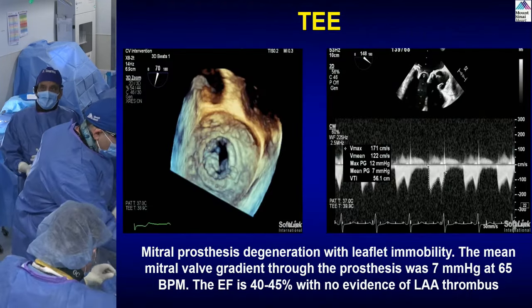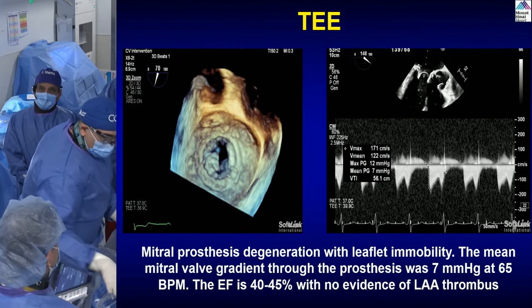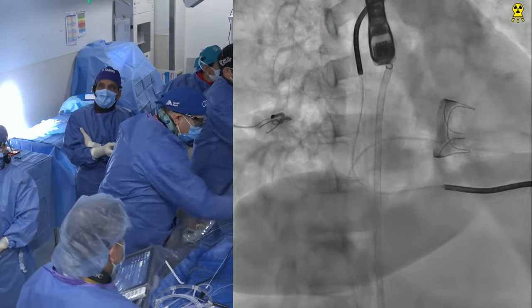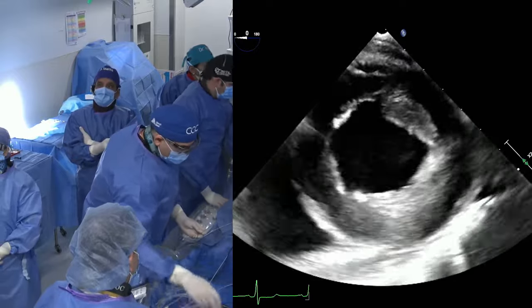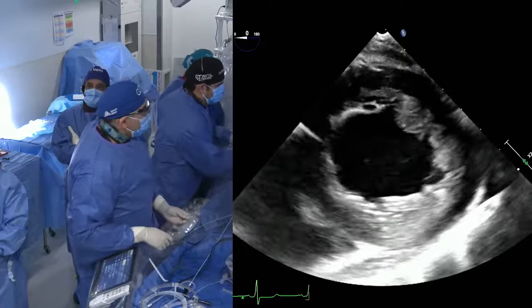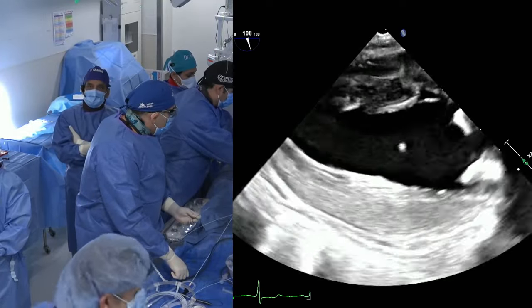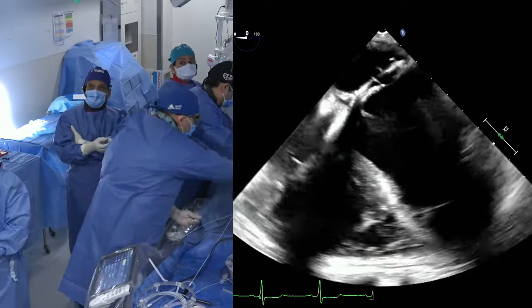So clearly we can show the live echo with the mitral now. Good morning. Thank you, Dr. Sharma. As you can see here, these are deep gastric images of the left ventricle, LV ejection fraction about 40%. Long axis, the same, about 40% LV ejection fraction.